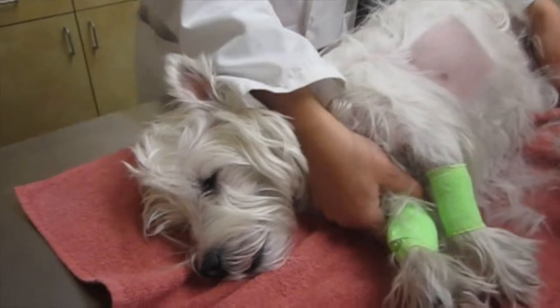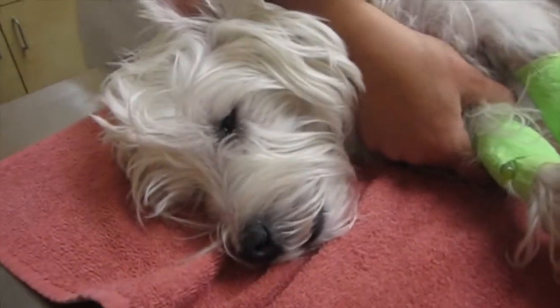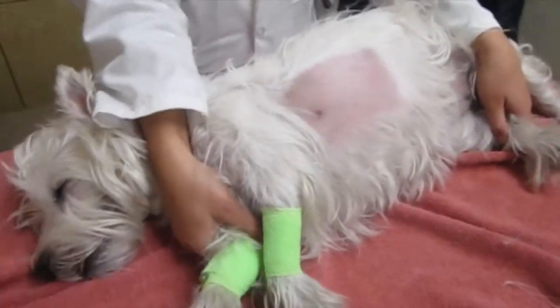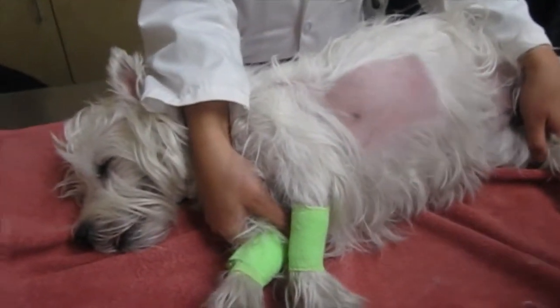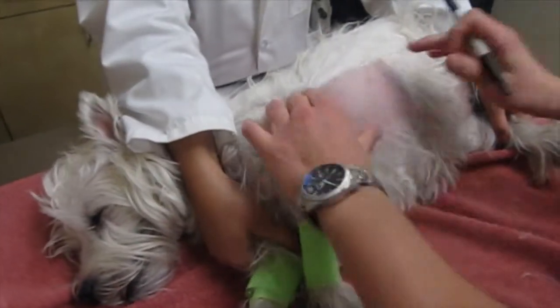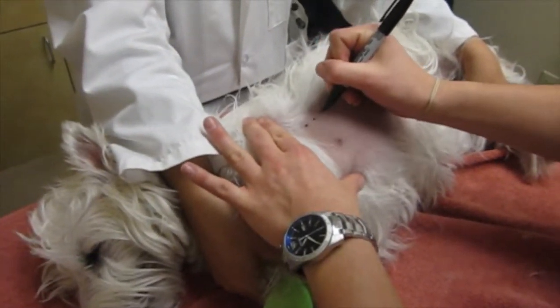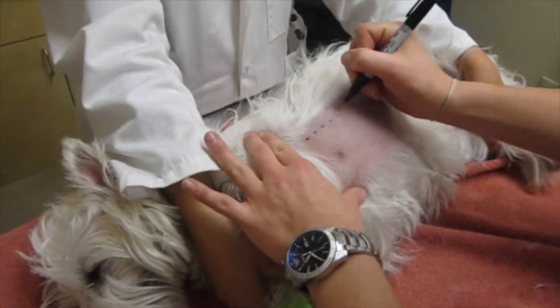There's Willow — you can see that she's still pretty awake but just relaxed and staying still. Next, we're going to put four rows of dots, ten each, with Sharpie.